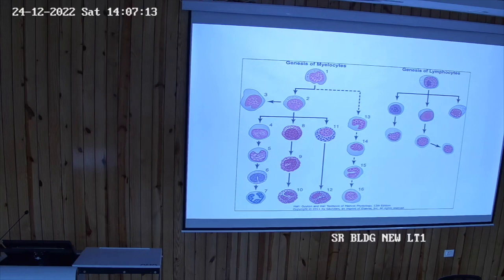Next comes lymphocyte. When we are focusing on it under the microscope, lymphocytes are divided into 2 types, small and large. Clear? The size of the small lymphocyte is equivalent to RBC, roughly 8 microns, and the size of the large lymphocyte is again 1.5 times that of RBC.